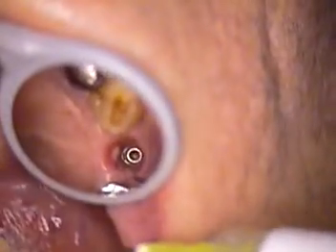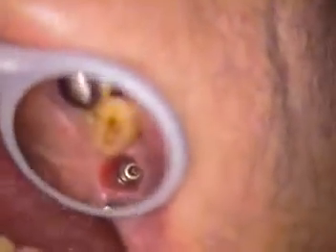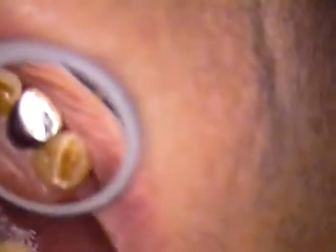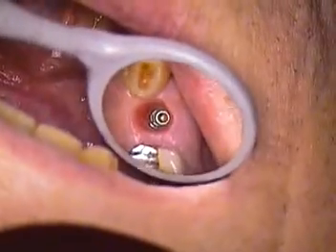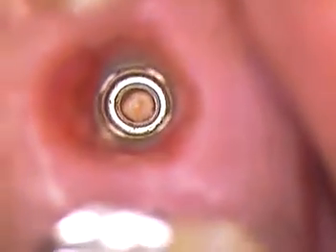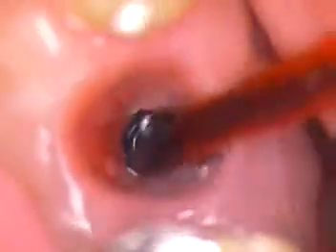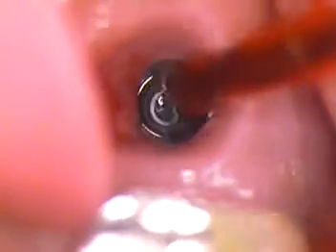As we normally do, we do a routine suction of the internal aspect of the implant. I'm going to go in and actually scrub that because I can see some debris down in there. I'll tip you back a little bit, Richard. Okay, so some normal dried blood in there — sometimes it's in there during a surgical procedure. I checked it last time, so we'll scrub that. This is chlorhexidine gluconate. I'm going to scrub that thoroughly.